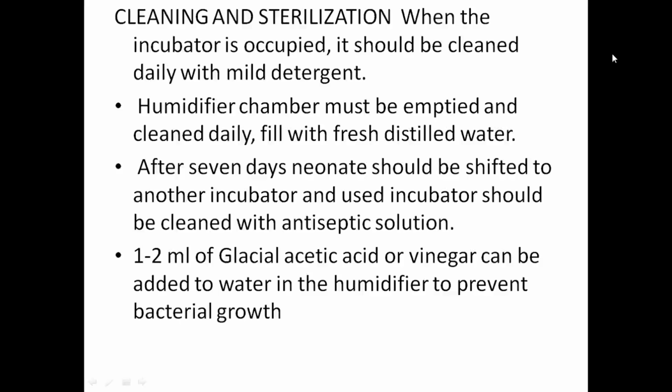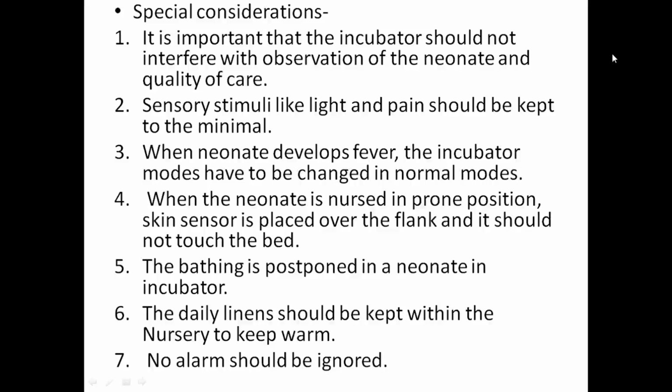1 to 2 ml of glacial acetic acid or vinegar can be added to the water in the humidifier to prevent bacterial growth. Special consideration: it is important that the incubator should not interfere with observation of the neonate and quality of care. Sensory stimuli like light and pain should be kept to the minimum. When the neonate develops fever, the incubator modes have to be changed to normal modes. When the neonate is nursed in a prone position, the skin sensor is placed over the flank and should not touch the bed. Bathing is postponed in a neonate in an incubator. The daily linen should be kept within the nursery to keep it warm. No alarm should be ignored.